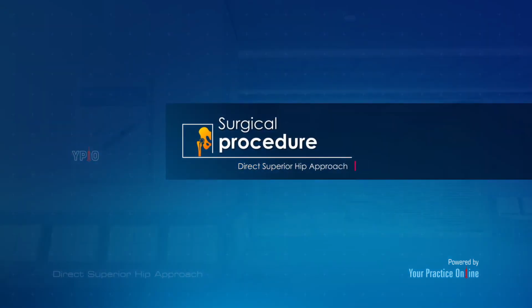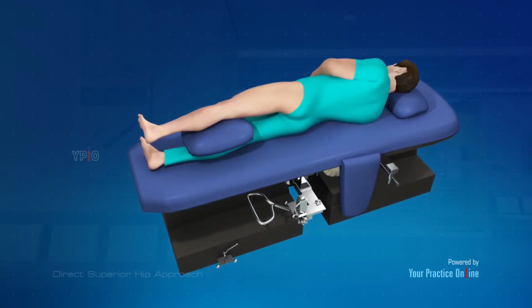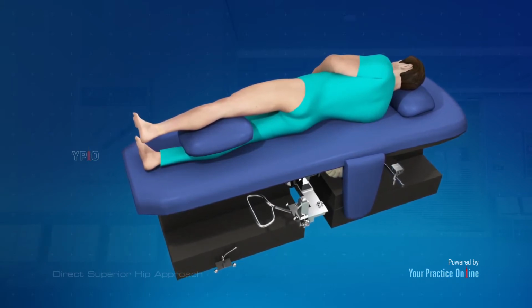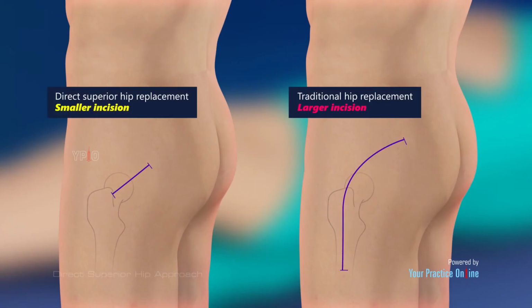Surgical procedure. Direct superior hip replacement is performed under general anesthesia. You will lie on your side for the procedure. A small incision is made on the side of the hip above and behind your hip joint. This incision is smaller and higher when compared to the posterior incision used during traditional hip replacement surgery.